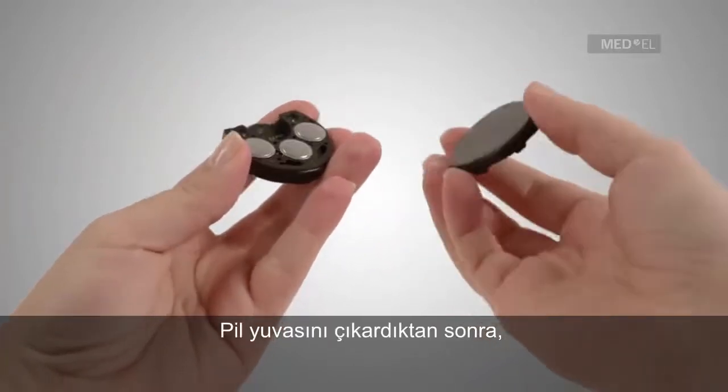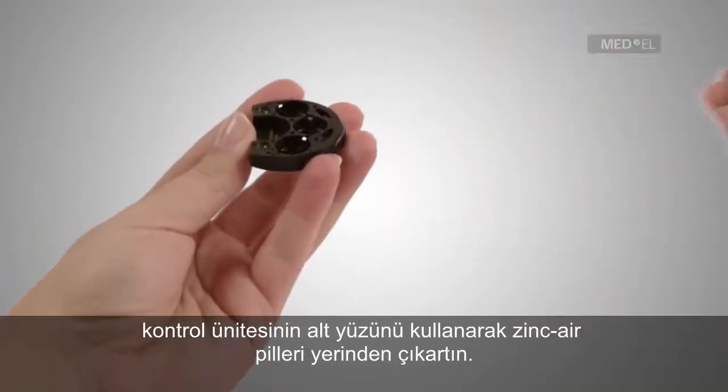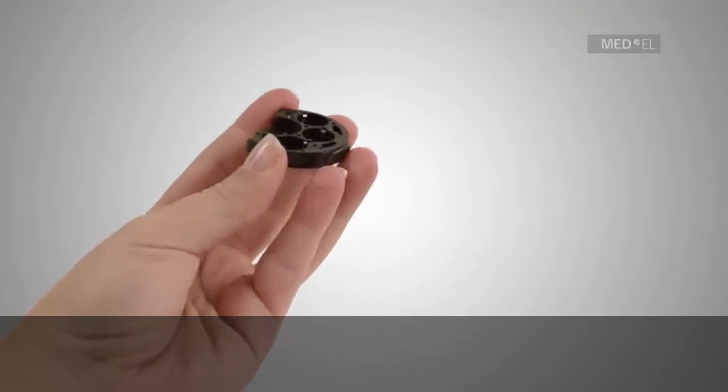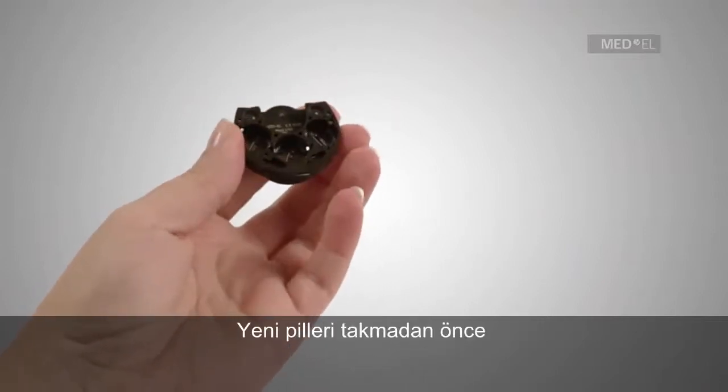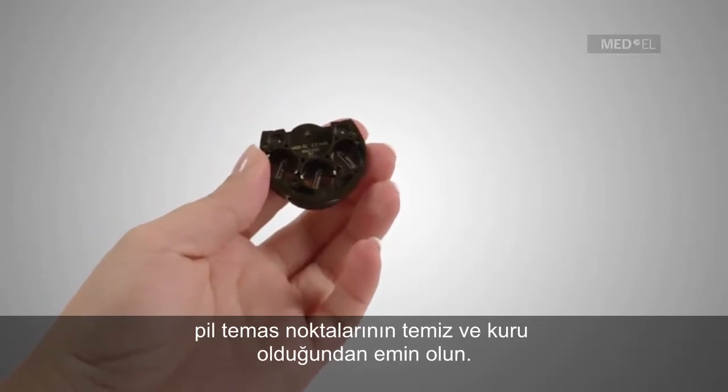Once the battery pack has been removed, use the magnetic underside of the control unit to remove the zinc air batteries. Before inserting the new battery set, make sure that the battery contacts are clean and dry.